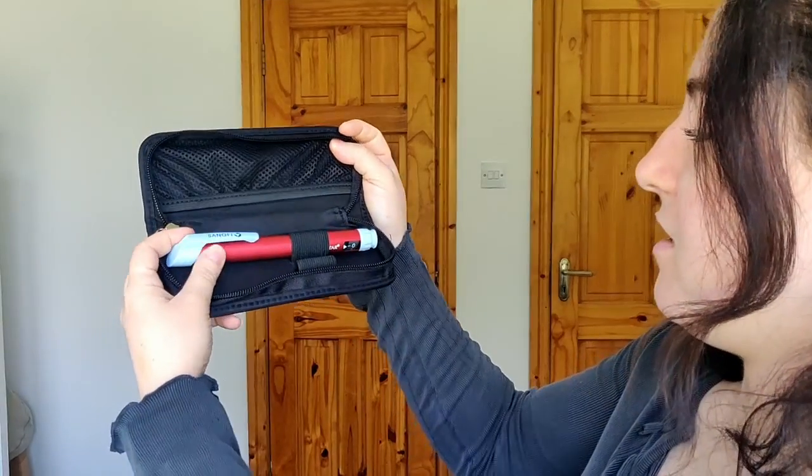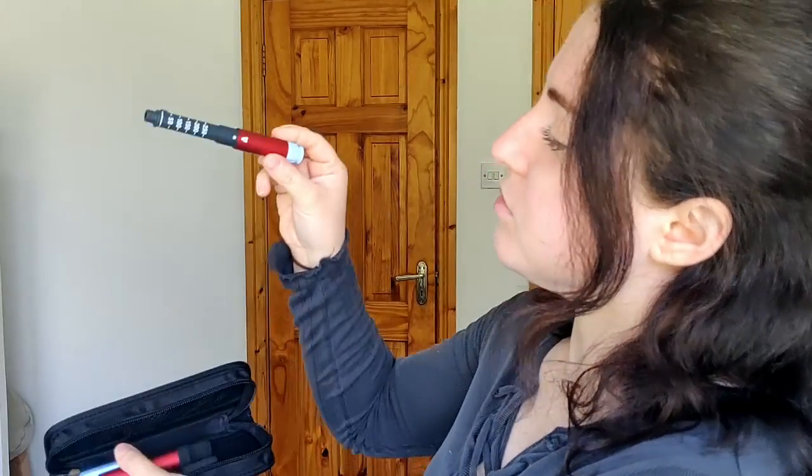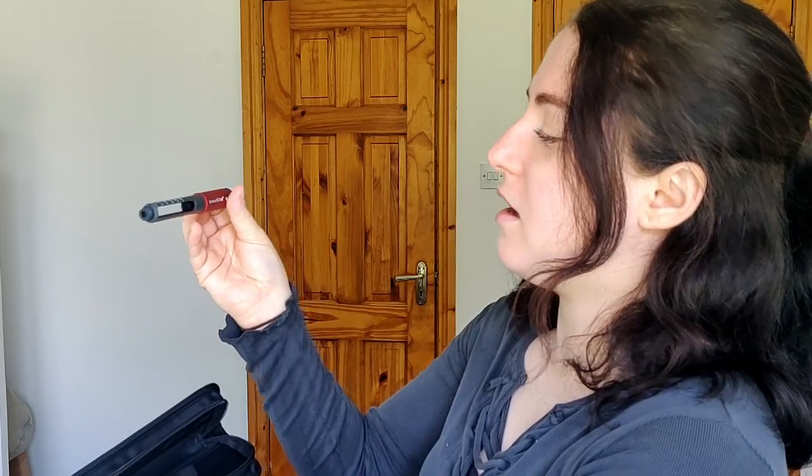Before I finish up, I found one random pen I honestly never used in my whole life — it's a Sanofi pen called the Junior Star. I'm not even sure what insulin would fit in it, probably Novorapid. Has anyone ever used this pen? I don't know where I got it from — I feel like maybe my parents went to a conference when I was younger and were handed promotional pens. I had to get all of this from my parents' house because I only had the Echo and my new Echo Plus smart pen.